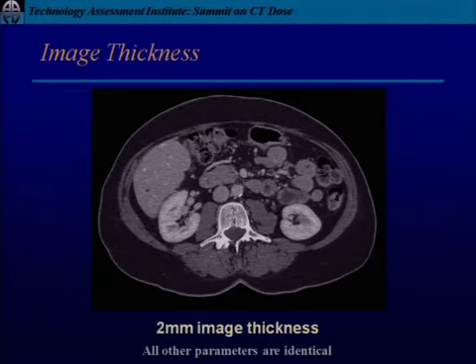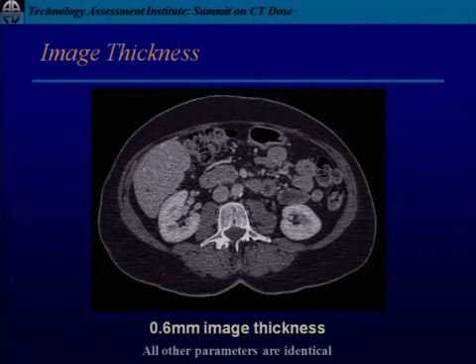It's possibly a cyst or some other object, and it is fairly high contrast, and it is very small, and it couldn't be seen, at least not by a physicist, at the 10 millimeter images or even at the 5s, but it's clearly obvious on our 2 millimeter images. What happens when we go to 1 millimeter? It becomes even clearer. The organ boundaries become a little sharper because we are not partial voluming them as much anymore. Let's go one more step to 0.6.